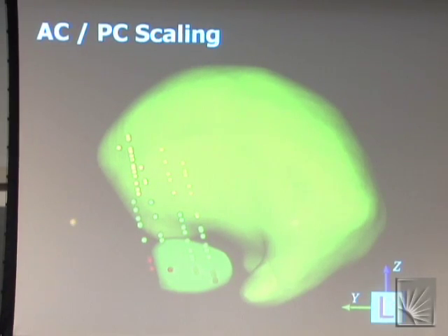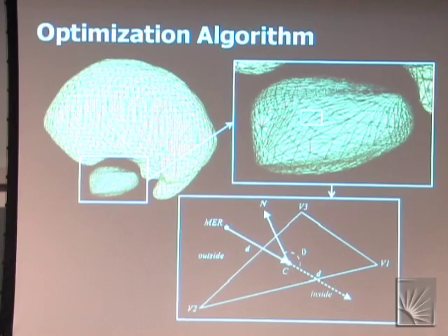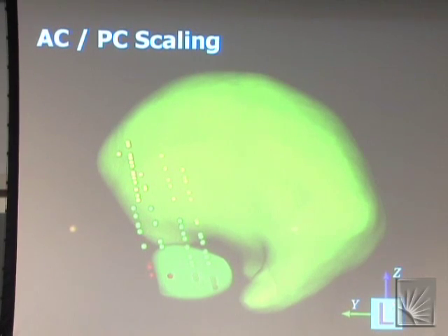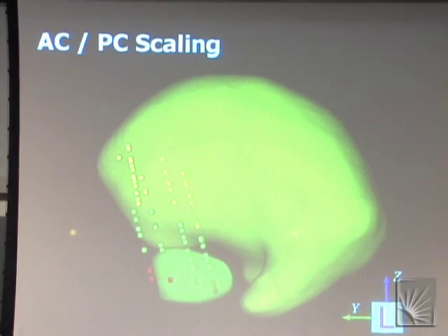And if you can calculate those things, and computers can do these kinds of calculations lickety-split, then now we've got the basis for actually taking this information and making these 3D volumes match as closely as possible to these microelectrode recordings, and in combination with that, the MRI that is in the background here.